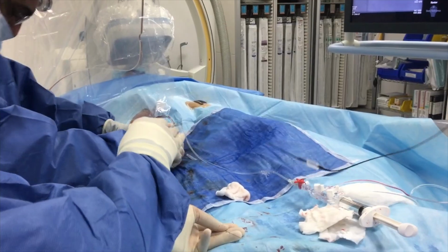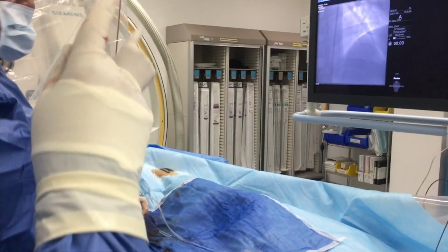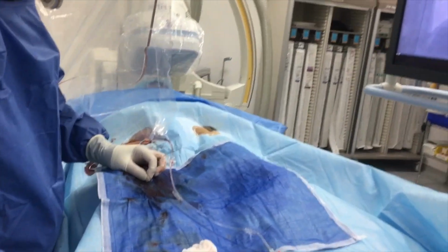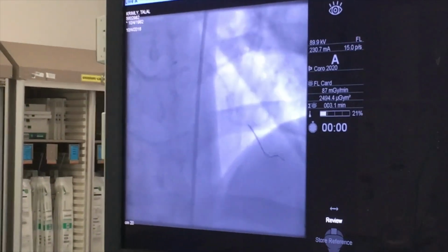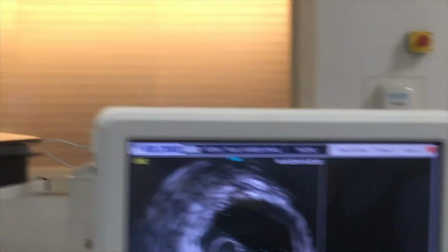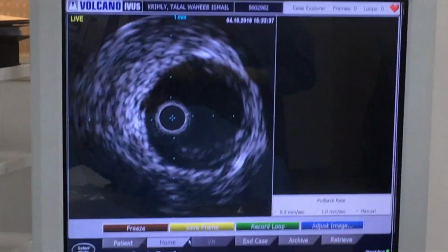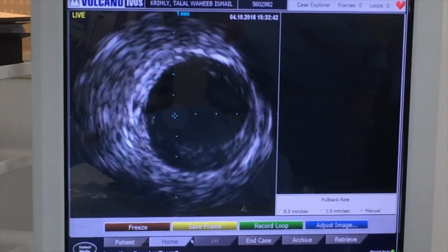So you need to take this all the way into the left main stem, and once you're in the left main stem, then we will stop with the IVUS catheter, and then we will record. So now you will see here. Okay, so there we stop now. Now look over there, show it over there on the screen. So that's a ring that we can see. Press the ring down button please. Ring down. Okay, good. So now we can take it further.